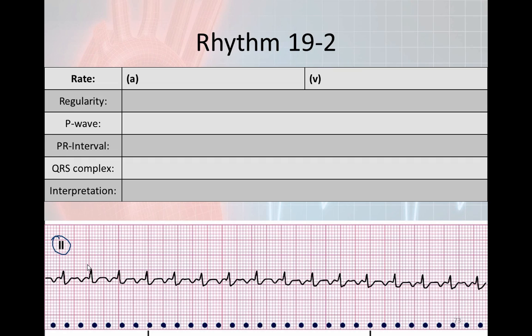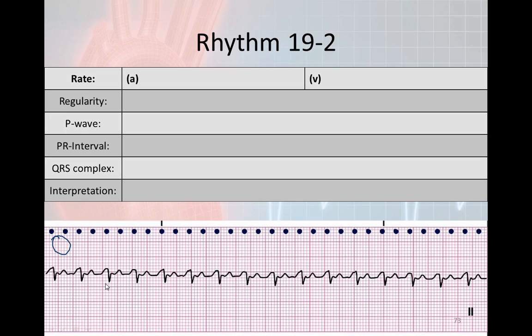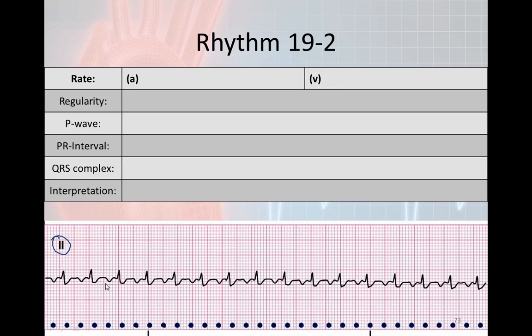The problem we have here is that, as you can see here, the F waves are not quite as prevalent as before. Even if you decide to flip this upside down, you still can't quite see flutter waves. You can't quite see a sawtooth pattern. That's why it's important to make sure that if you have any abnormal rhythm, you have to grab a 12 lead on that person. But since this is actually a previous patient, this is a different time than whenever they took this EKG or this rhythm strip.